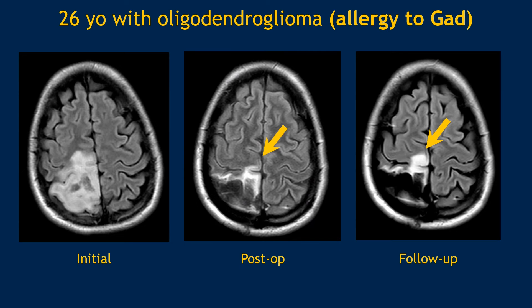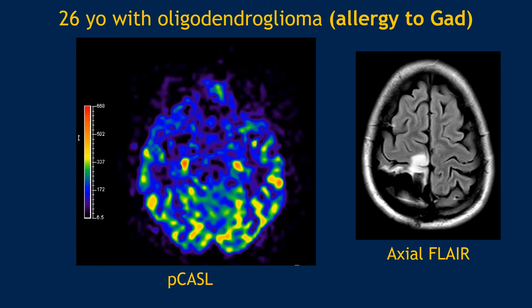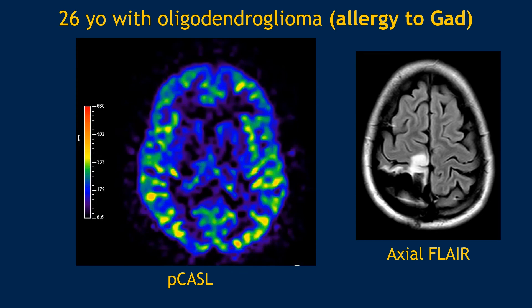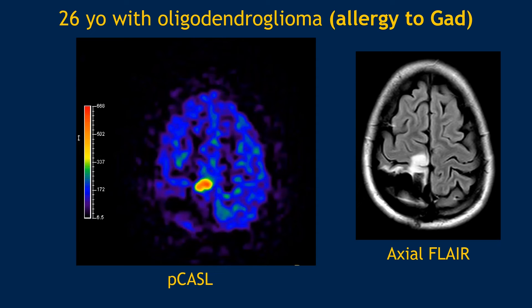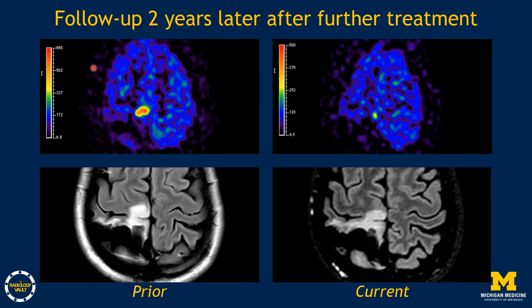This is a patient with a history of brain tumor who was allergic to gadolinium. They had an initial brain tumor that was resected, and immediately post-op there was a nice resection cavity with some T2/FLAIR signal. A few months later, there was new nodularity in the right paracentral lobule. We performed ASL, and this area of nodularity turned out to have very elevated perfusion. On the left is the initial imaging showing increased perfusion and nodularity, and two years later after treatment, that same nodular area has decreased in size with decreased perfusion, consistent with treatment response.